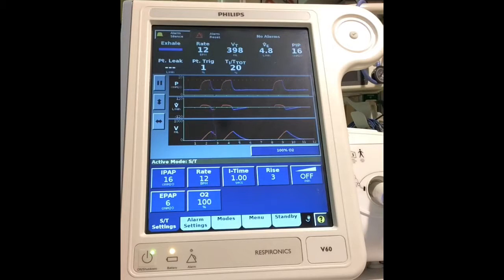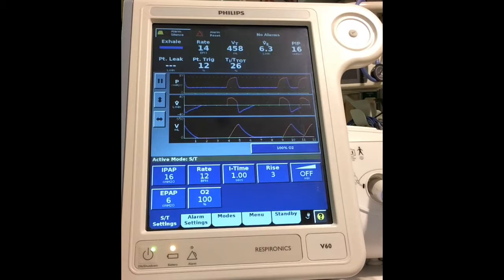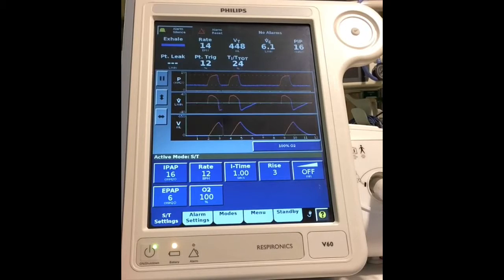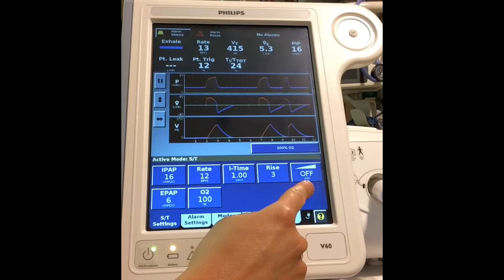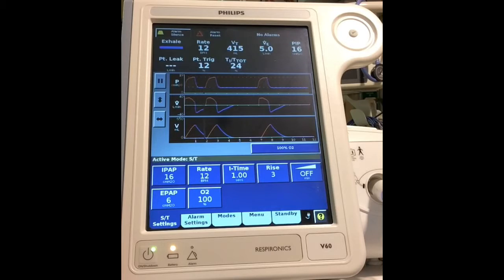So that's how I use my rise. I'll move that up and down to try and make that patient feel a little bit more comfortable. Now you're also going to see this little icon over here, this tab. That's your ramp. We generally do not use a ramp. A ramp is used to slowly build up that pressure for patients. In a critical setting, we don't generally use it, so I won't talk about that.